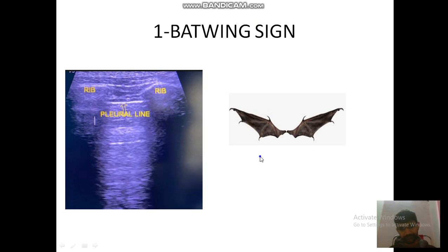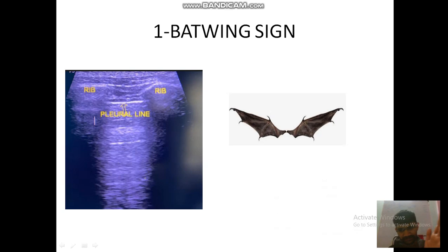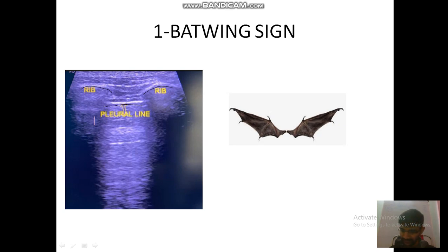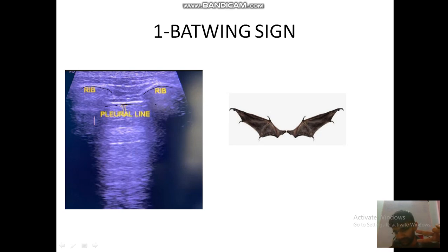Coming to the first sign on the ultrasound: when you place the curvilinear probe on the chest wall perpendicular to the chest wall, you see this type of image on the ultrasound monitor. You can see there are two hyperechoic lines — the first line, the second line — and just below that, we have a third line. When you keep the probe perpendicular to the chest wall, there are two ribs and between these is an intercostal space. The ultrasound probe waves get reflected by the rib and appear as a hyperechoic line, and when they pass through the intercostal space, the parietal pleura reflects it, giving you another third hyperechoic line.